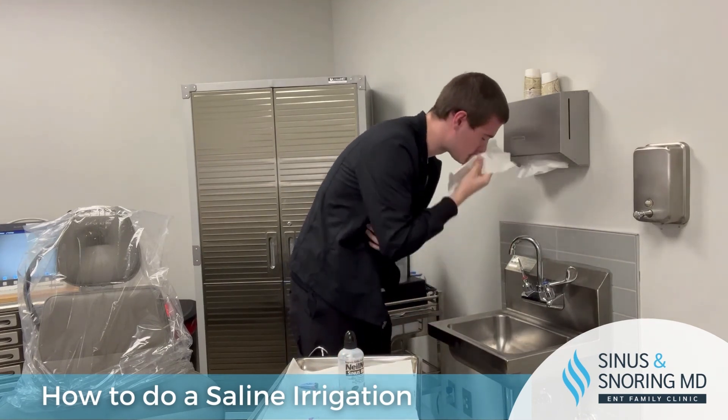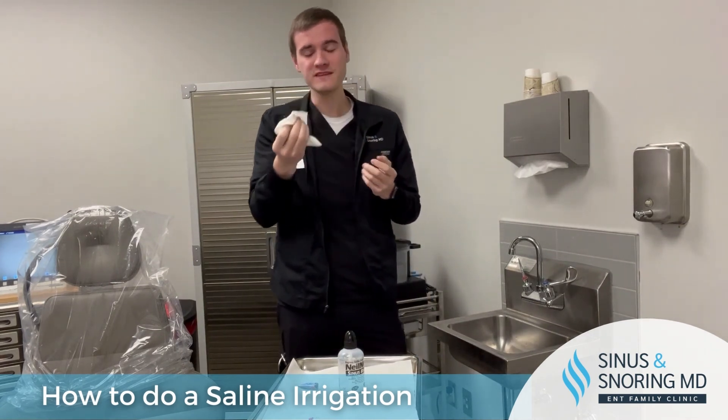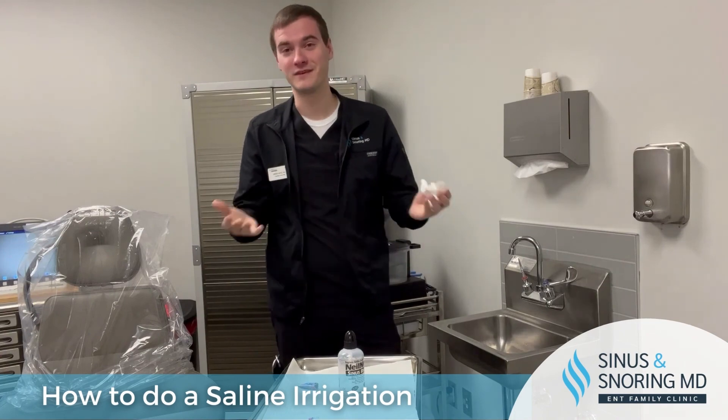There you have it. It is normal for a little bit of water to run out the front of your mouth. If it does, it tastes like salt water because it is.